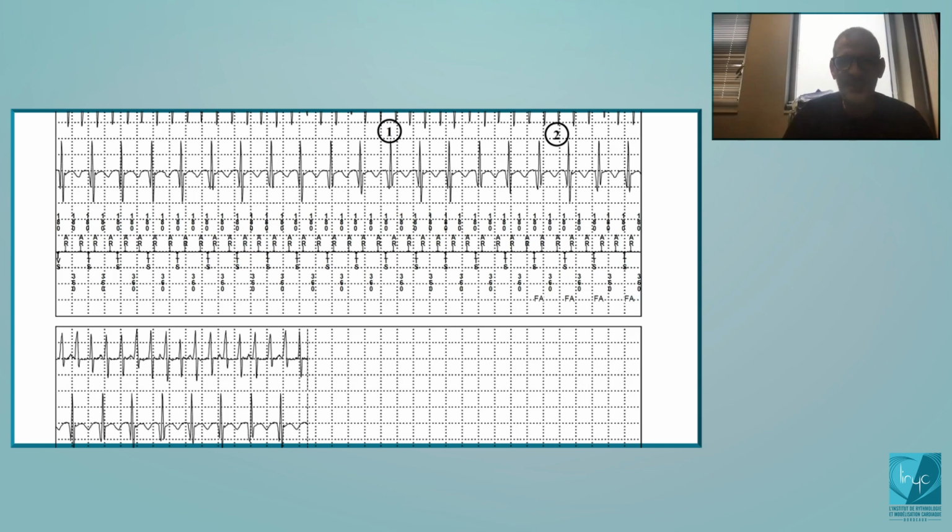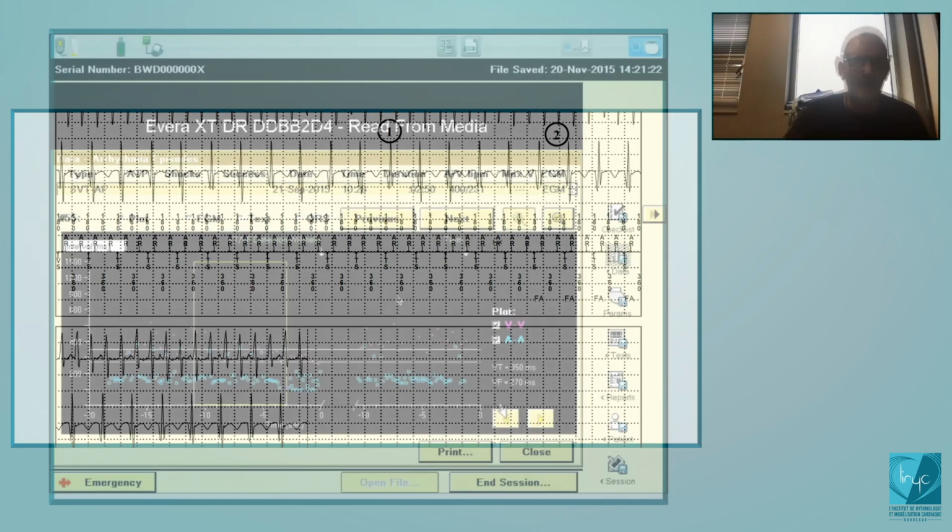And in this case, if it is a diagnosis of SVT, no analysis of the wavelet. Let's consider that that could be different in terms of morphology compared to the reference. That will not be analyzed. If the device considered with the PR logic, that's an SVT, that's the end of the analysis.